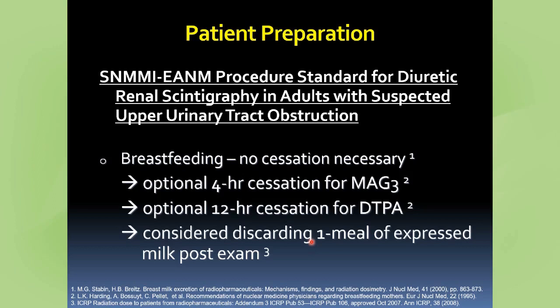If you look at the recommendations out of Europe, they say for MAG3, you should withhold breastfeeding for 4 hours, and 12 hours for DTPA. The ICRP publication just says simply express one meal after the exam and discard that before resuming breastfeeding. Again, doing nothing at all if they were to resume breastfeeding wouldn't cause any significant exposure to the child based upon estimates.